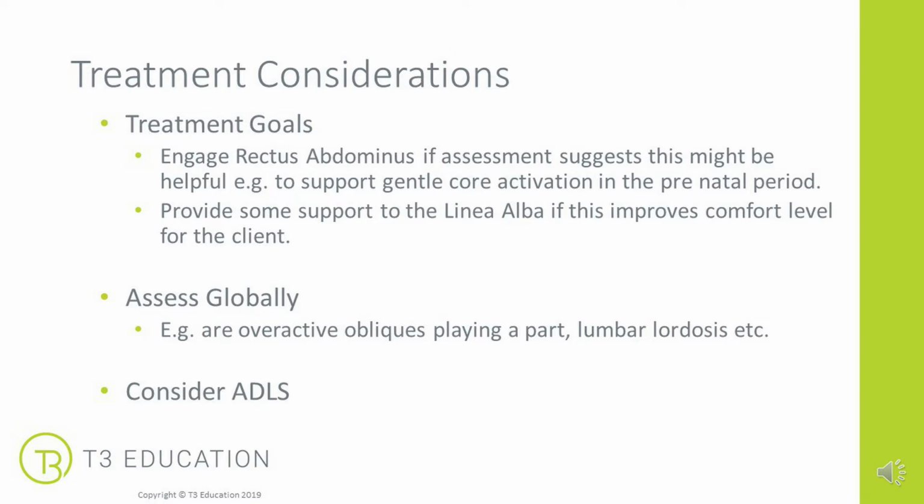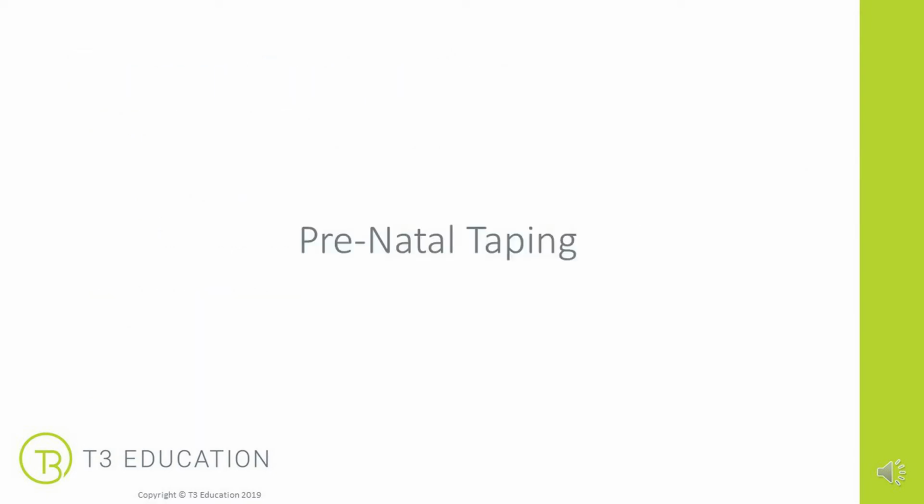And again, taping is not going to close that separation at the midline. Indeed, it's a natural process as part of the pregnancy. But if we can use tape to help alleviate some of the symptoms where clients are feeling pain, discomfort, or problems moving, then it might be a worthwhile addition to your treatment planning. Note that treating a pregnant client is contraindicated unless you are qualified to do so. And if you are qualified in treating pregnant clients, then taping is a very useful tool to assist as part of your treatment planning. So let's take a look at the taping itself.